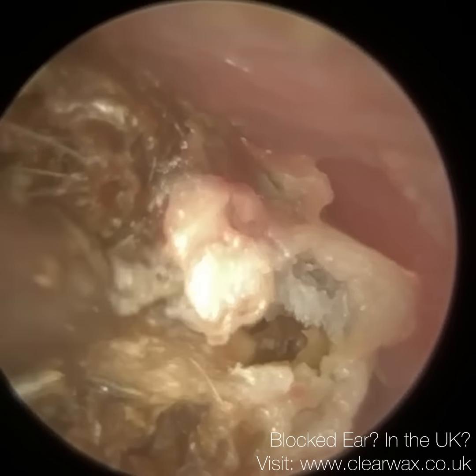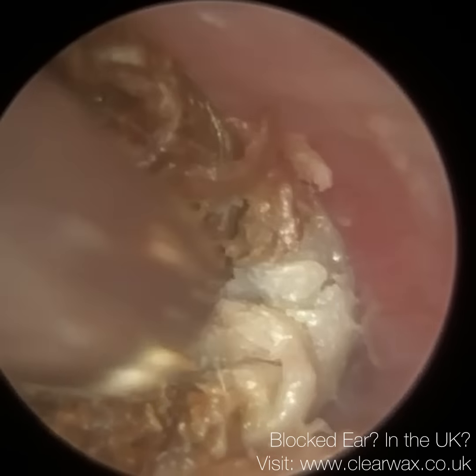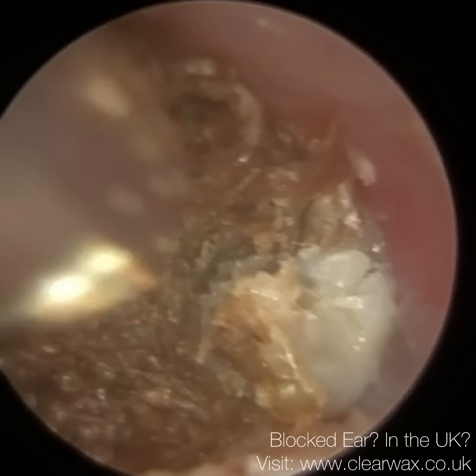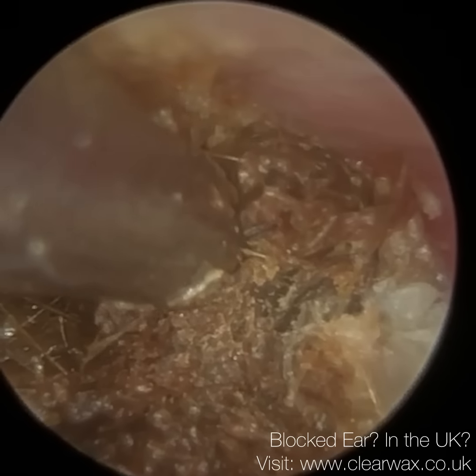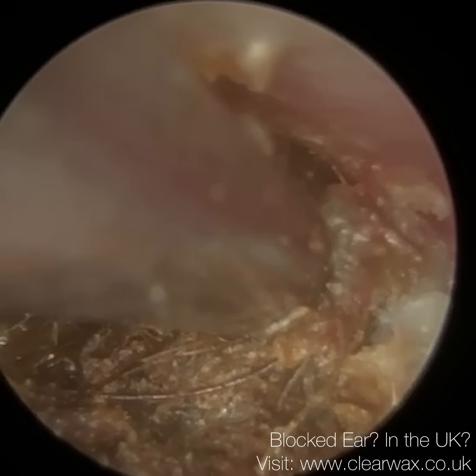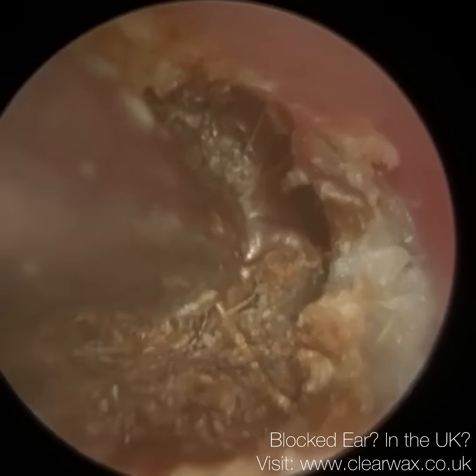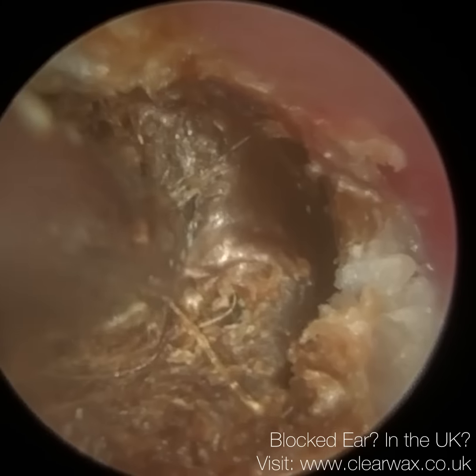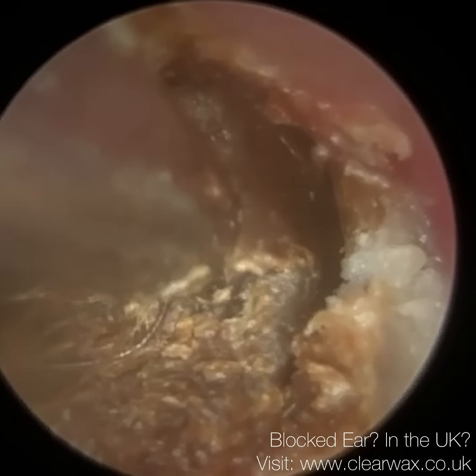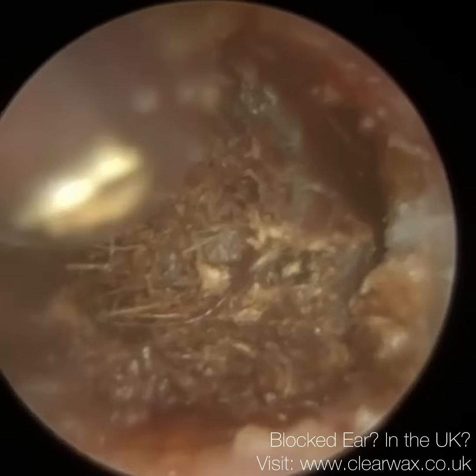is used quite often, and carbamide peroxide contains hydrogen peroxide and urea in equal amounts, and it also contains glycerol. And the urea tends to break up the keratin, which is within the skin cells. Keratin is a protein not only found in skin cells, but it's found on your hair strands, your fingernails, for example. But the negative of urea, it makes the wax or the skin extremely mushy, and it can make it really, really difficult to remove. So if there's a choice between carbamide peroxide and hydrogen peroxide, I would use hydrogen peroxide.